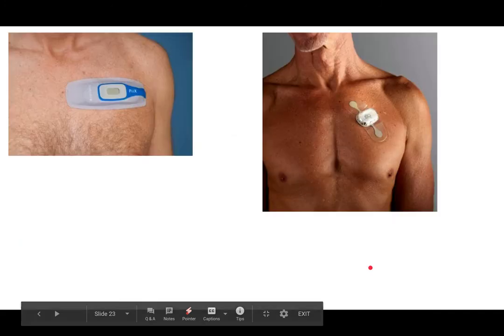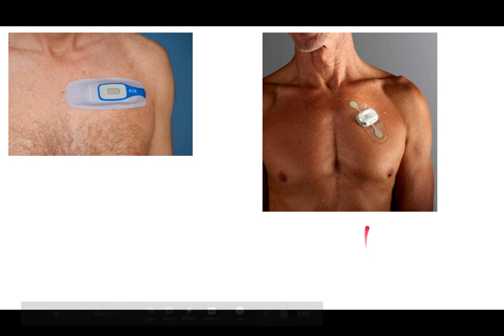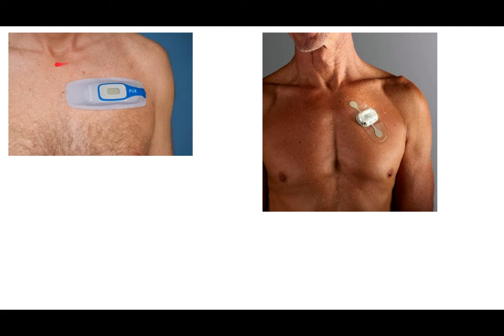These are pictures of the wireless monitors that we often use. This one right here is the one provided by iRhythm. It's called a Zio Patch monitor. This is another one called the Pix. I actually haven't seen that in person. But these are really handy because they are wireless. Once they're adhered, after usually the initial 48 hours, they've got a pretty good stick on there, and you can actually take a brief shower with them or work out and maybe sweat a little bit.